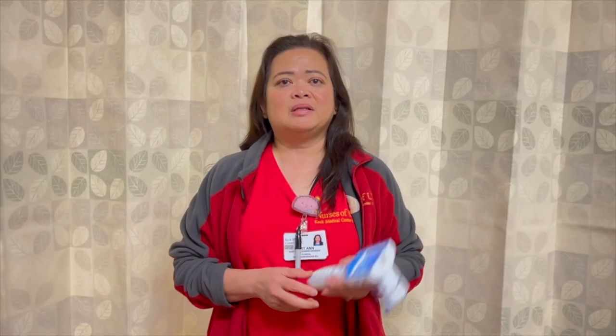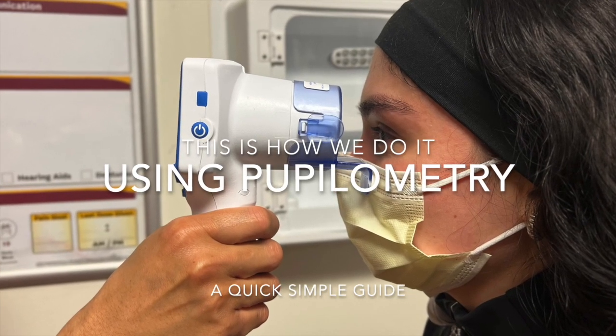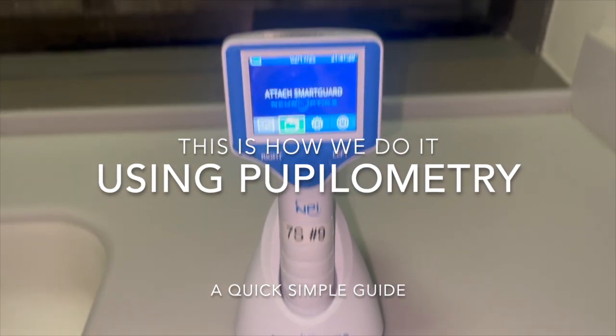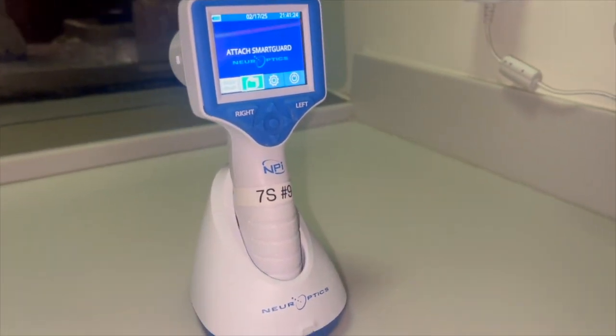Hi, my name is Marianne and this is how we use Pupilometry. A Pupilometer is a non-invasive handheld device that is used to provide an objective measurement of the pupils before and after a light stimulus, as well as the pupillary reactivity to light.